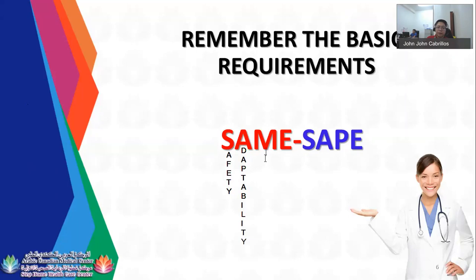Then M is material compatibility. It should be compatible with any instruments or any materials in CSSD. E is for efficacy, effectiveness for a certain equipment. Not all equipment are capable in low temperature sterilization methods.